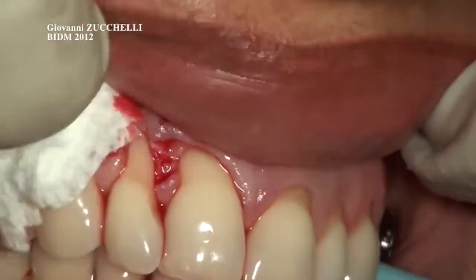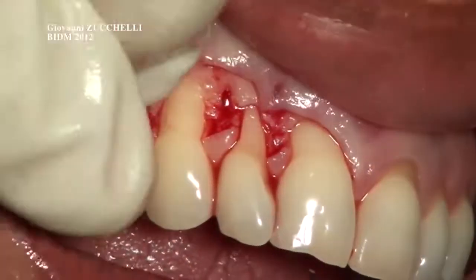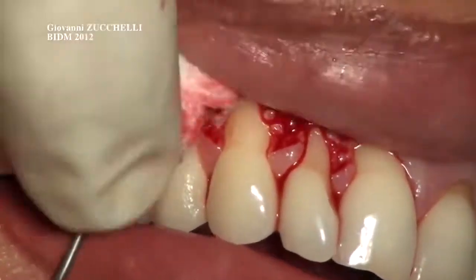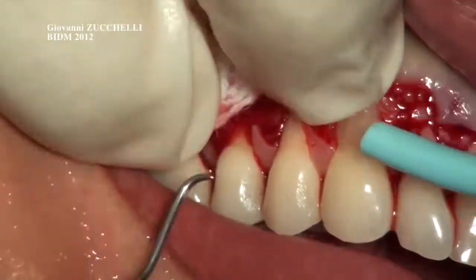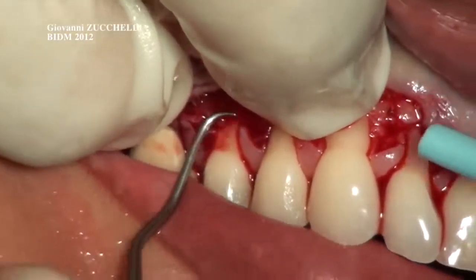Now we go to the 5, and finally to the 6. So I isolate the 5 completely with my fingers and go.